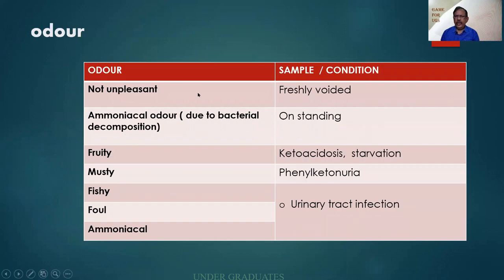And what is the odor of urine and its importance? Some books give it as pleasant. I will not agree with that. So I mentioned it as not unpleasant when freshly voided. But on standing, it develops an ammoniacal decomposition and a worse smell.